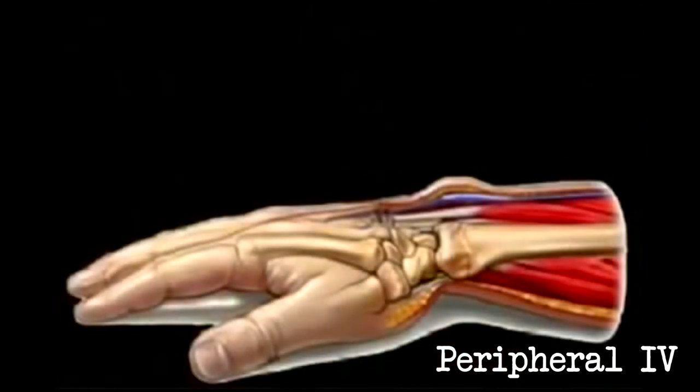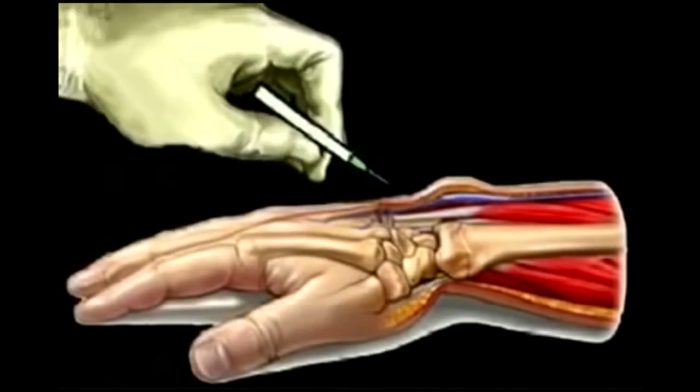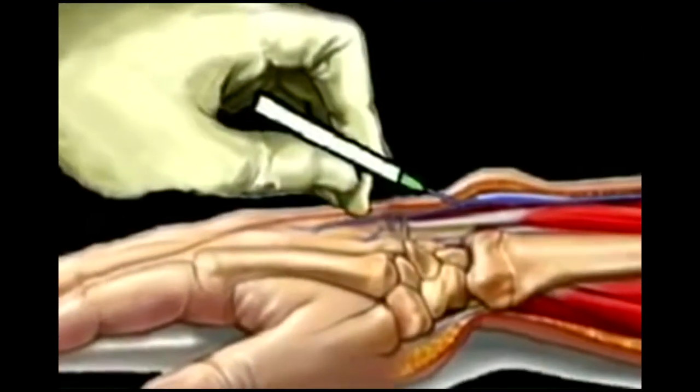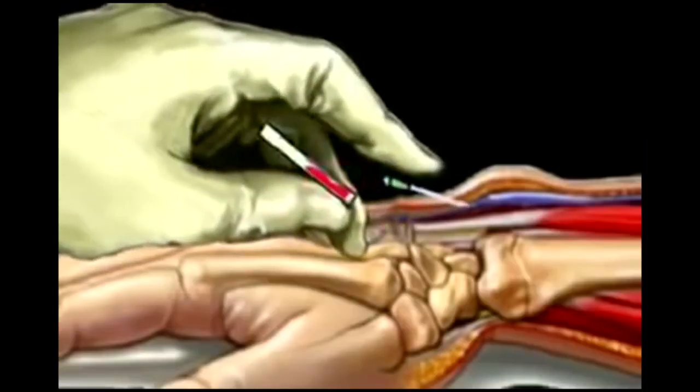Now we look at the different types of intravenous insertion. First is the peripheral. The most common type of intravenous catheter is designed for peripheral access. This is the IV line commonly put in the hand or forearm when a patient is admitted to the hospital. It is short, approximately 1 inch long, and is inserted into the vein by a nurse. Peripheral IVs come in various sizes, ranging from 24 gauge, the smallest, to 14 gauge, the largest.